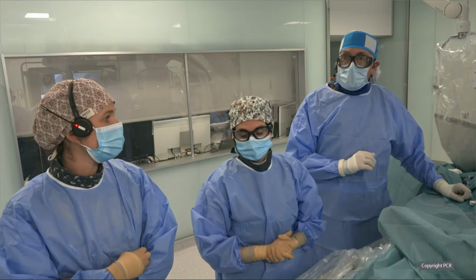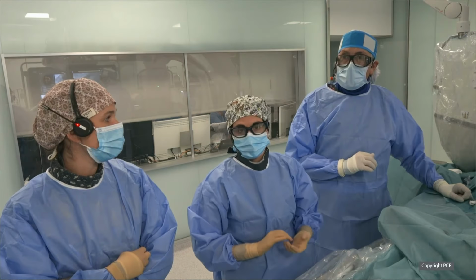So, okay, this is what you see with angiography, and this is what you see with CT reconstruction, where you can see immediately the advantage of seeing this huge granularity, this nodule of calcium that is located in the ostium of the circumflex, and that, as you rightly said, extends into the distal left main. Now, if we go to the next slide, we will show you what we think was very important to understand. So this is the rationale why this was very helpful for us.